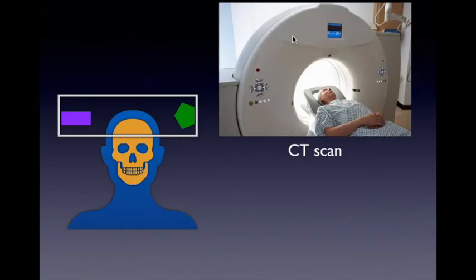So that's why if you look at CT scans now, medical CT scans would have something like this, where you would have fixed detectors, and from those fixed detectors, you would have a similar configuration. You have a patient at the center, you have an X-ray on one side, a detector array on the other side, and then as the X-ray moves around, it sends out an X-ray image and will be detected by an opposite detector.